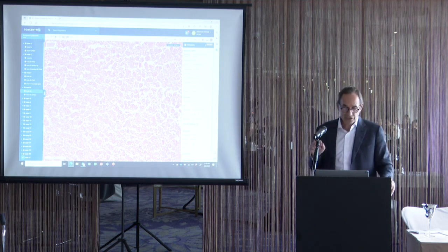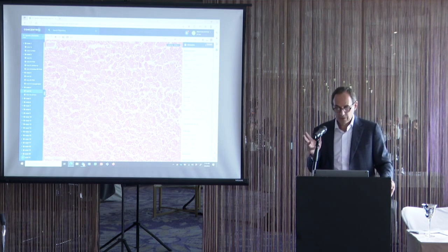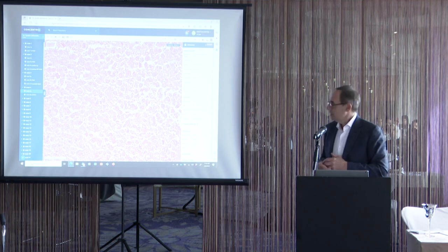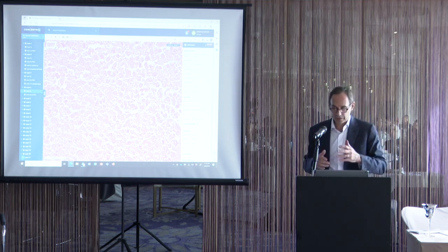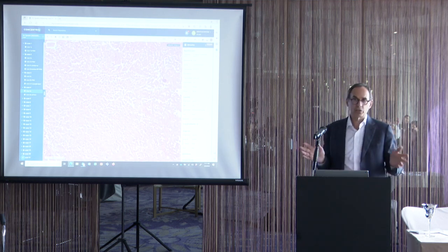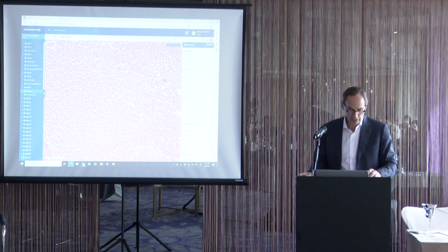And in the testis, sometimes when you see cellular necrosis, you can actually make out even what type of tumor this is. So looking at this, it looks like seminoma. The individual cells, you can still see these big central nucleoli. But it's important to recognize and don't just call it necrosis or don't call it torsion or something else. And I've seen cases where pathologists have had areas where it was all dead and they just called it benign necrosis and the patient went undiagnosed for many years and developed metastatic disease.